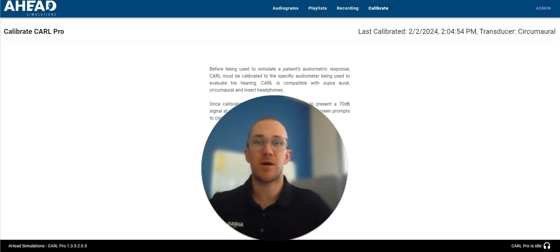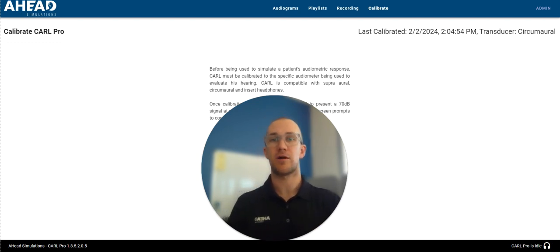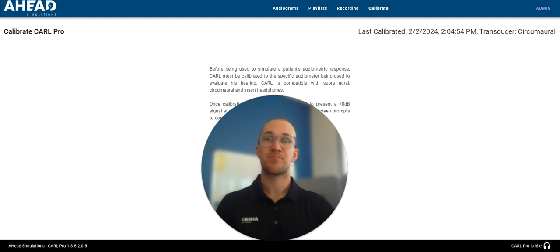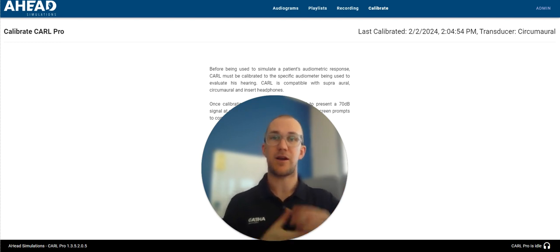A few things to note about calibrating Carl. It never requires a technician to come and recalibrate your Carl at a certain frequency. We have a calibration feature inside of the software which will use your calibrated audiometer to calibrate your Carl. So we're assuming that when you're using Carl for audiometry or masking, you are going to be using a calibrated audiometer for that. So we're going to calibrate our Carl to your audiometer, and I'll walk you through that in a moment.